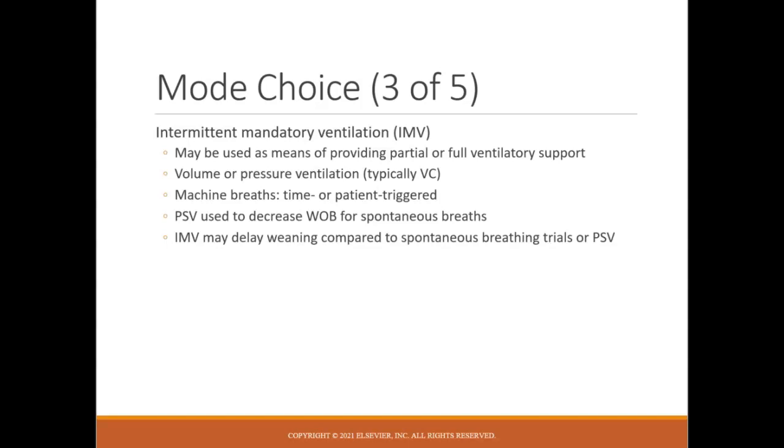Most studies have shown that there used to be big proponents of using SIMV and weaning on SIMV as kind of an adjunct to getting the patient off the ventilator. But again, most studies show that using SIMV isn't benefiting the patient and it's actually delaying extubation. So it's better, as you've probably seen in your clinical weaning trials, if you watched a patient go through daily weaning trials or spontaneous breathing trials, we're not putting them on SIMV. We're just switching them to pressure support of 5/10 and extubating from that.